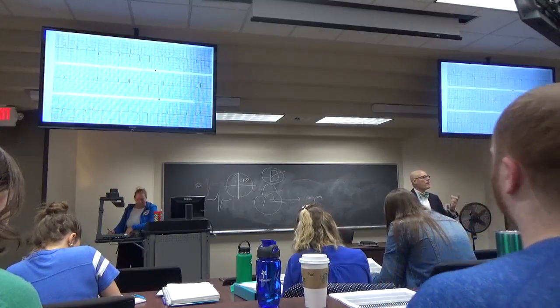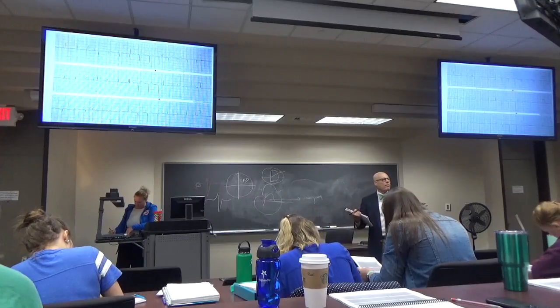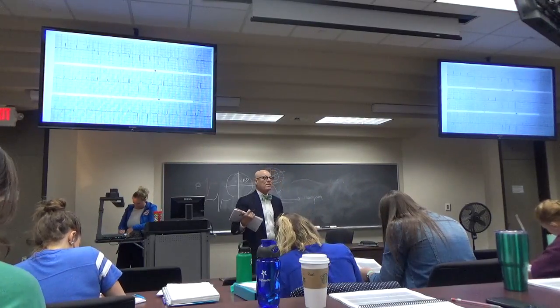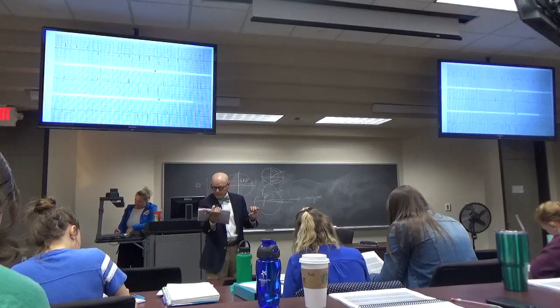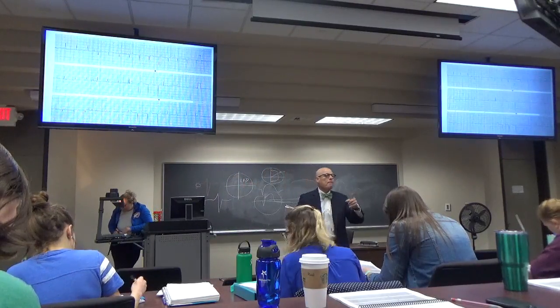Because there's an infarct right next to it. It's the anteroseptal wall, which is next to that lateral wall, low lateral, high lateral. It's a little surprising to me that the T waves in 5 and 6 aren't flipped, but in 6 they are kind of abnormal.